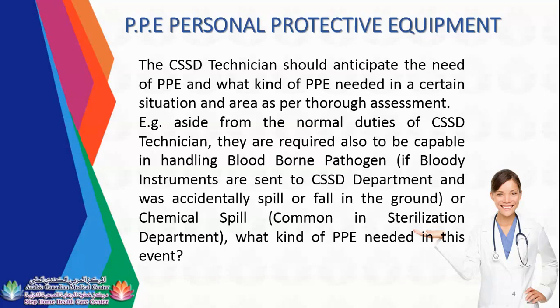If bloody instruments are sent to CSSD, the statement here, guys, because ideally, according to the protocols, there are no bloody instruments sent to CSSD. All instruments must be disinfected at the point of use, which means your nurse should disinfect or decontaminate the instruments first before sending them to CSSD. So if bloody instruments are sent to the CSSD department and are accidentally spilled or fall on the ground, or a chemical spill, common in sterilization departments, occurs, what kind of PPE is needed in this event?